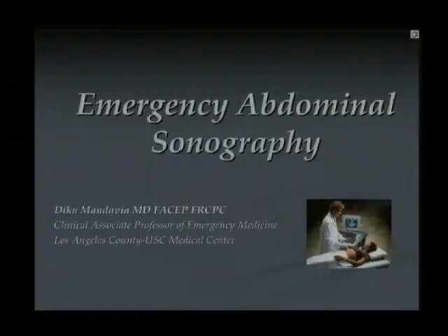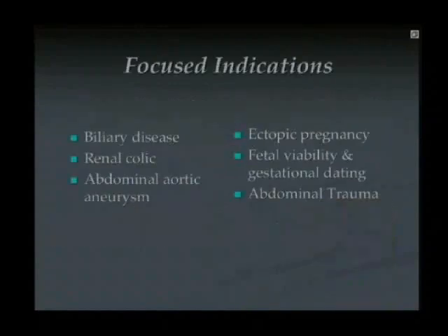Okay, now let's switch to abdominal ultrasound. Obviously, ultrasound is a very important modality in abdominal pain. We're using it on a regular basis and have been doing so for a long time. And there's a lot of these indications that I think we can do ourselves. So we're going to talk about some of these now.